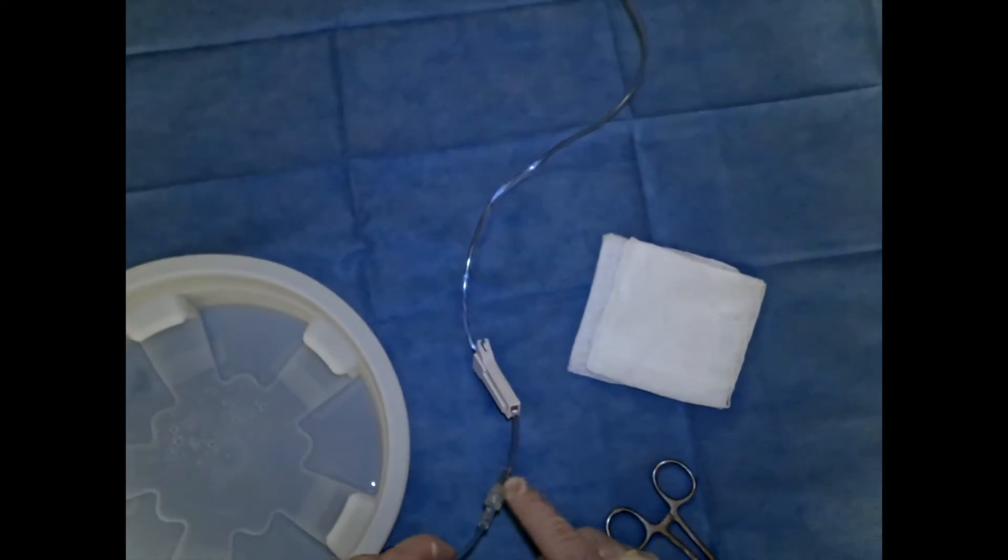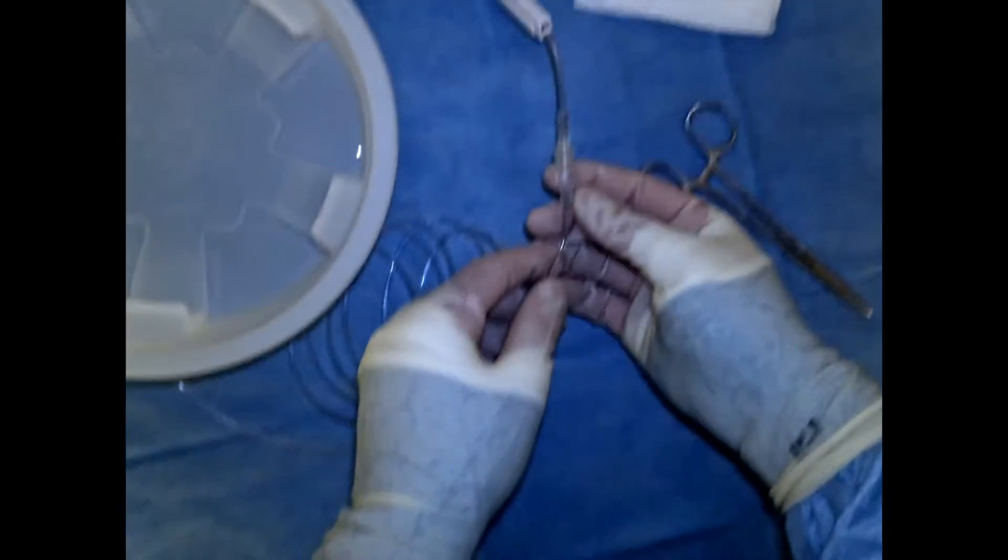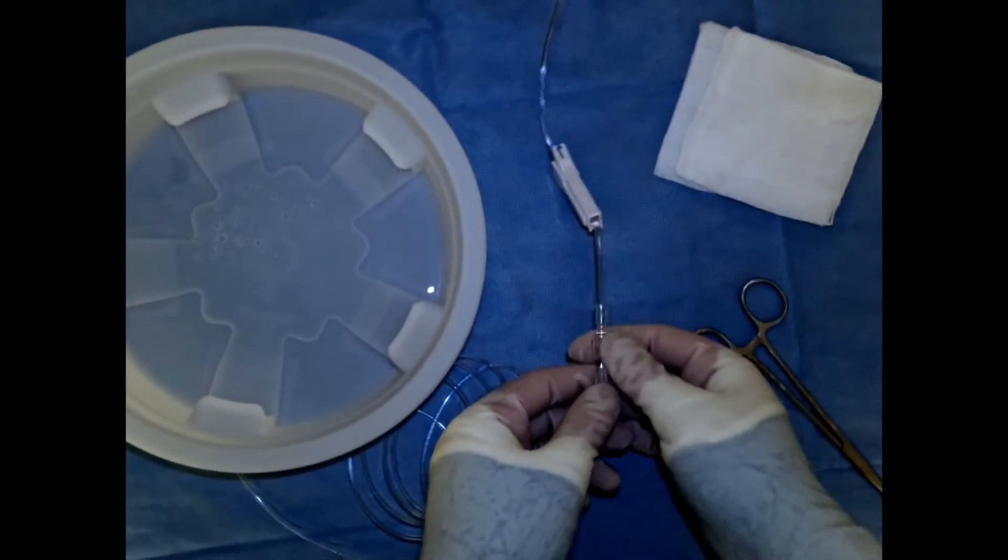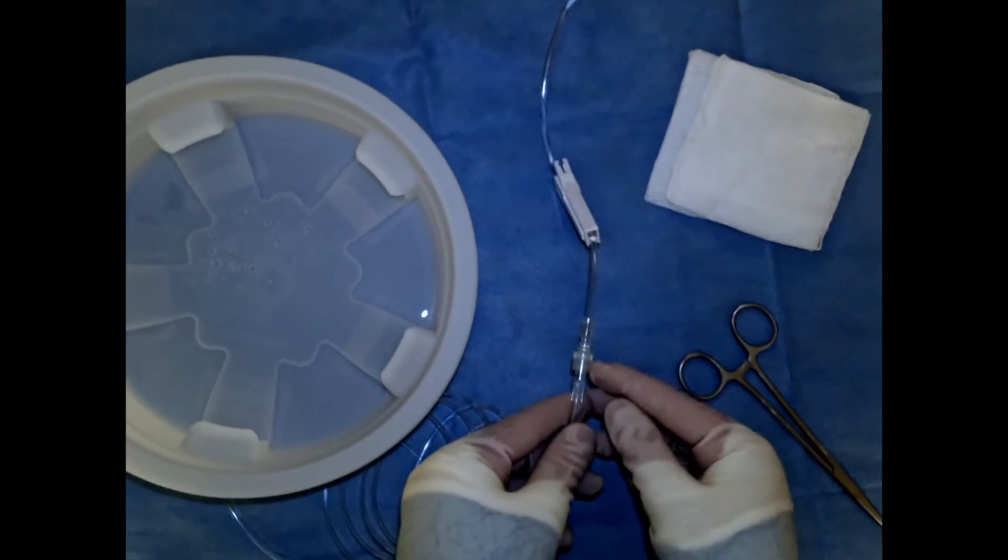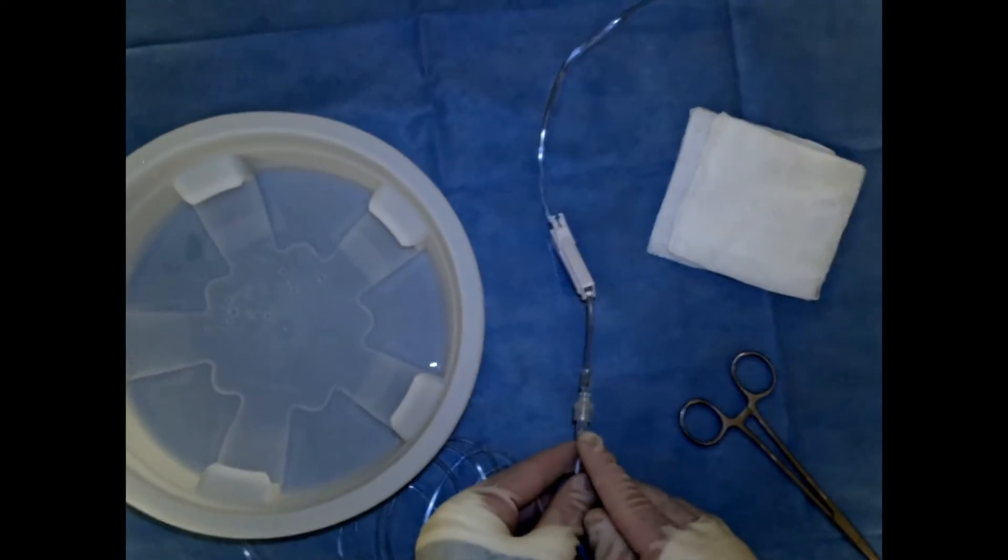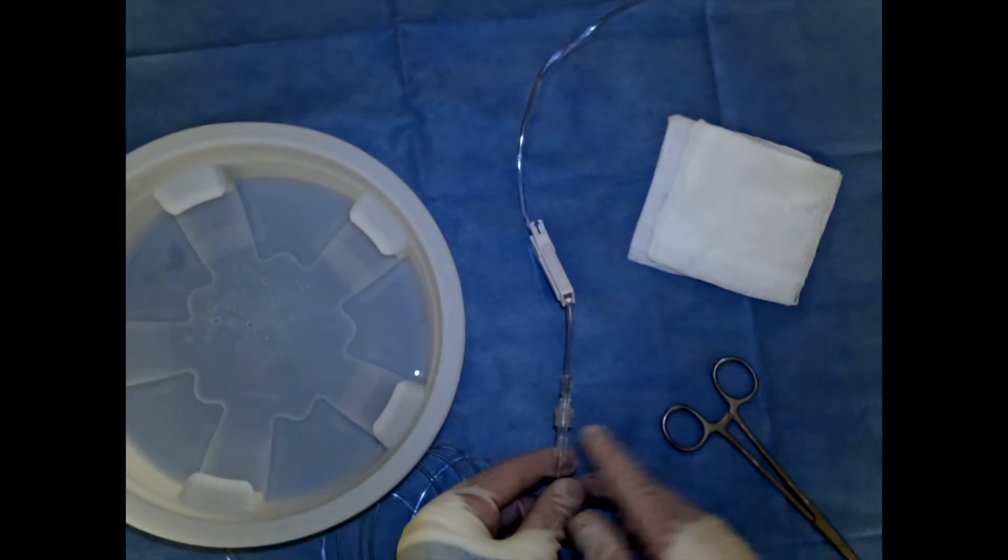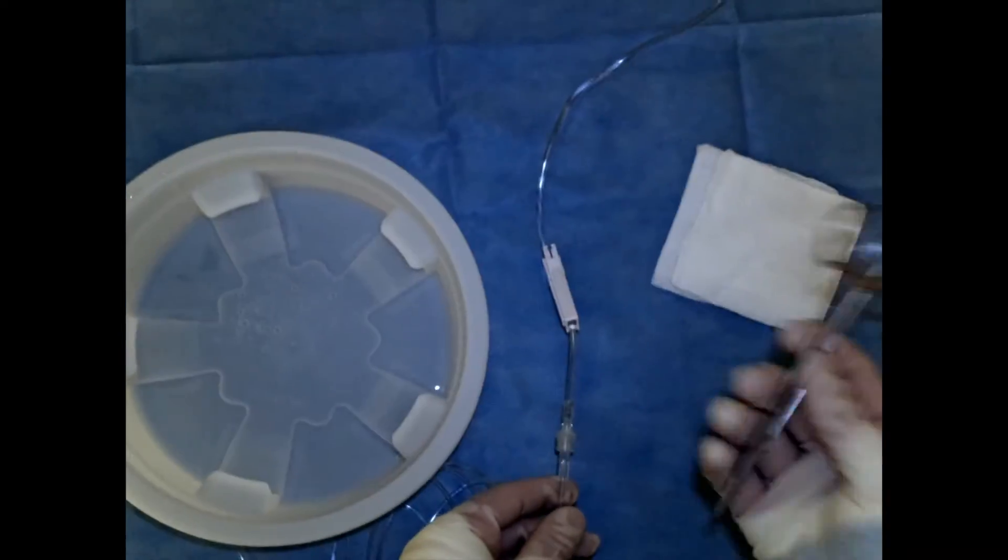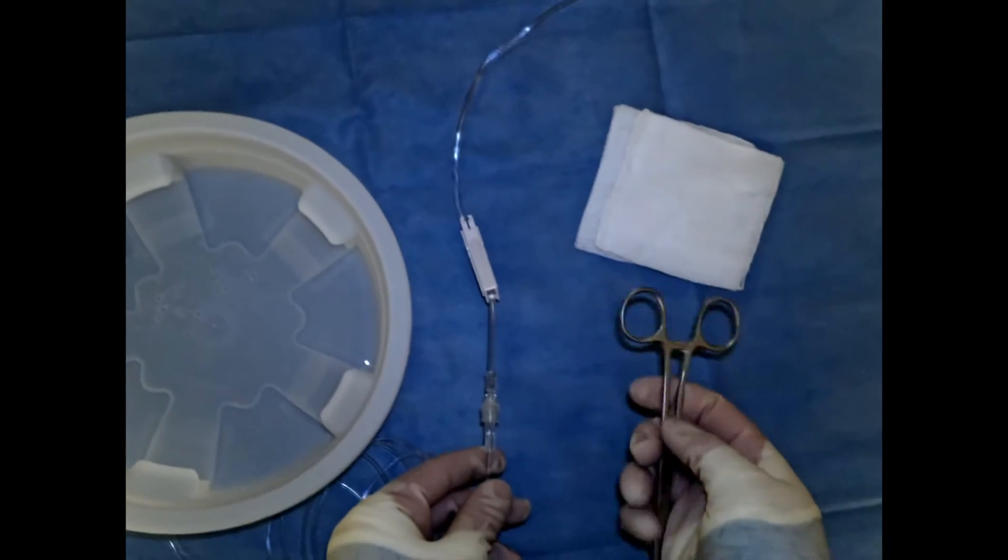You want to have something like forceps, something you can basically tap the line with, especially at connections, to dislodge any bubbles. Anywhere we have an extension line that was added to our drip line system, anything that has an air interface can trap bubbles, and we want to have a way to kind of dislodge them. It's good to have a metal utensil like some forceps or needle drivers to tap the system with.